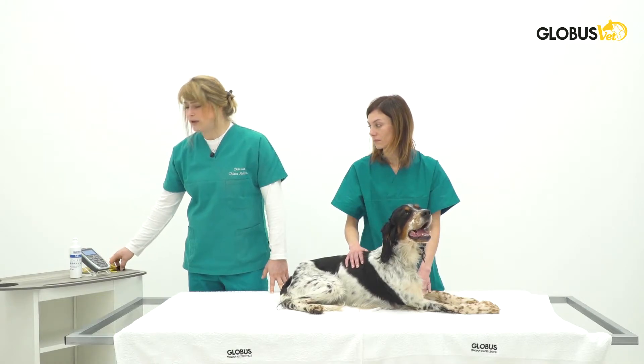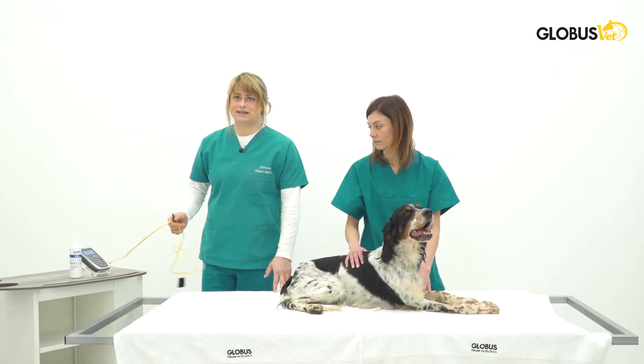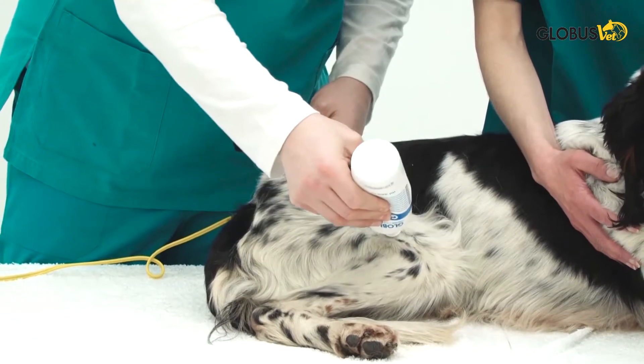We will have to set for intensity, but before setting the intensity we have to put our electrodes on the patient. Let's put some gel over the patient where we would like to place the electrodes.